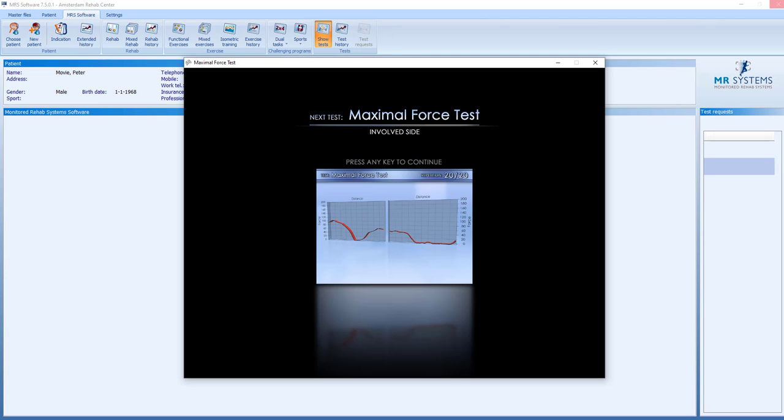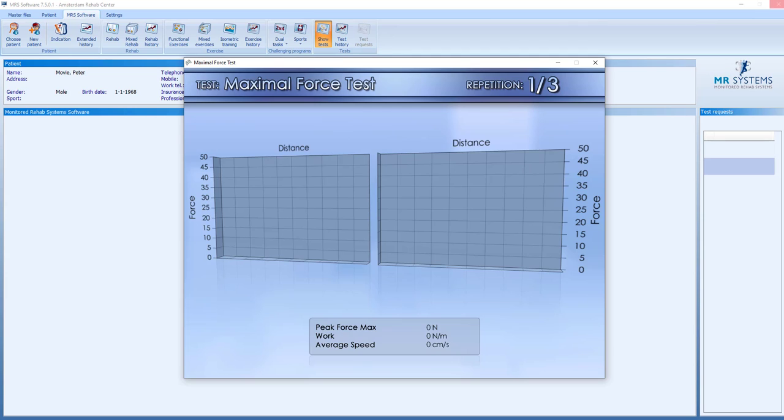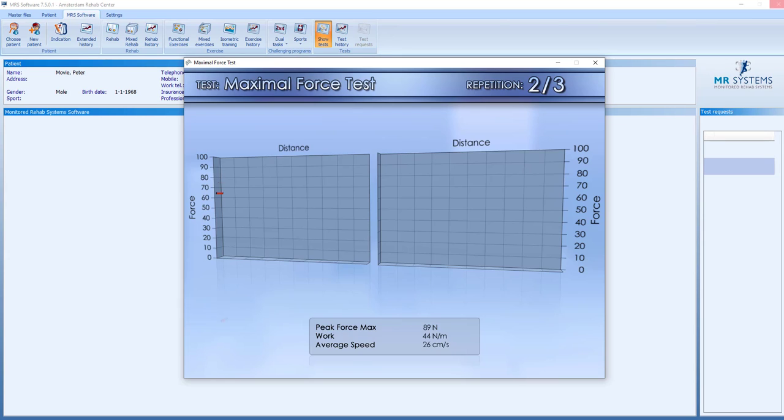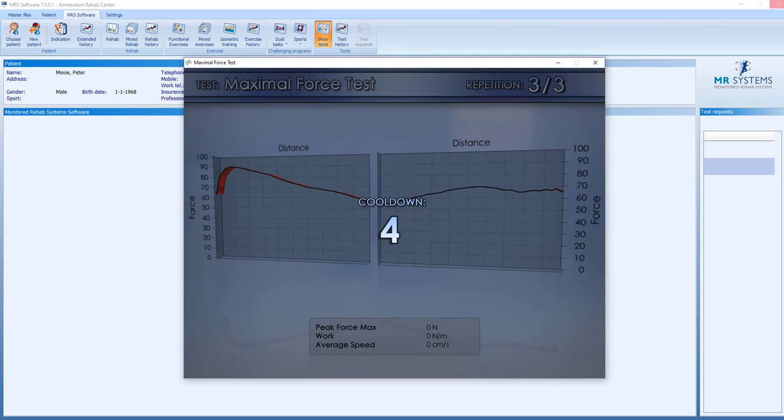We accepted the test and now move to the involved side. We get the same three trial repetitions to perform as a warming up and find the weight for the one repetition test. We do the three repetitions.